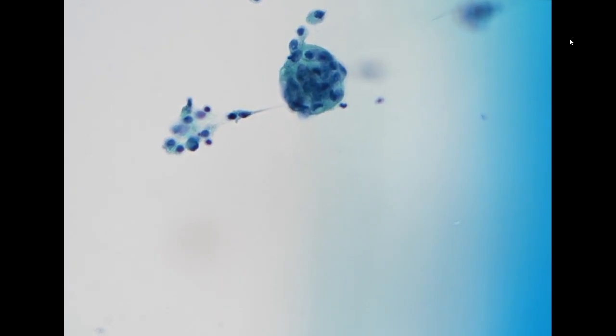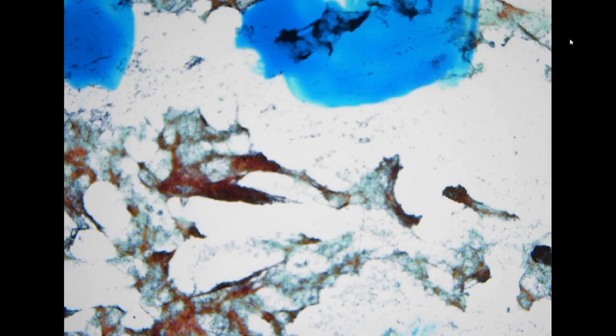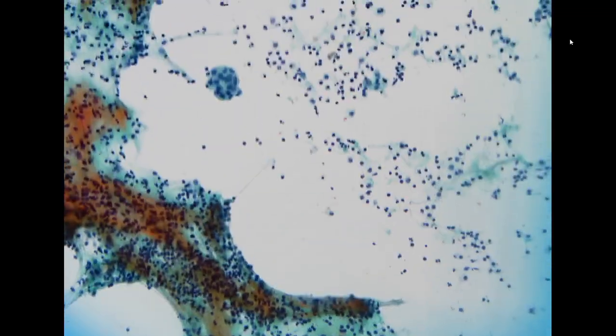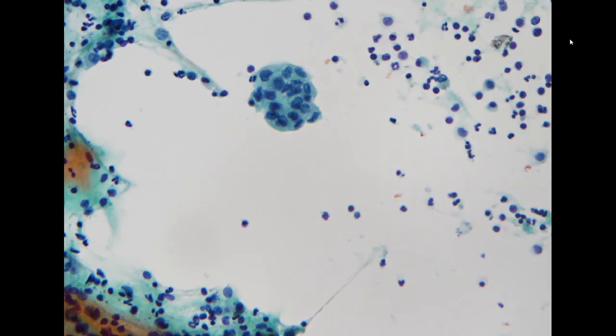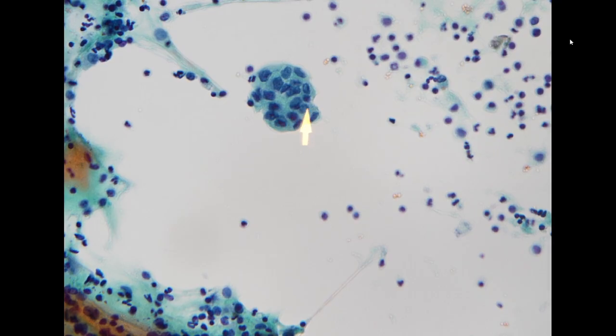If you take a look at the requisition sheet, she actually had a past history of pancreatic cancer. So the morphology is compatible with pancreatobiliary features, and it is very common that we will see a more well differentiated type of nucleus.